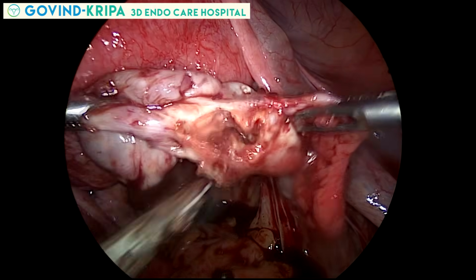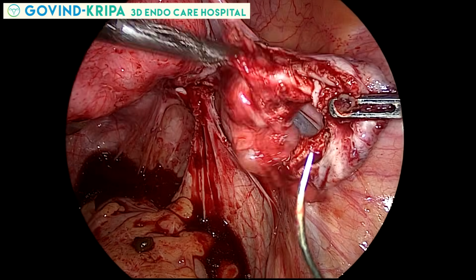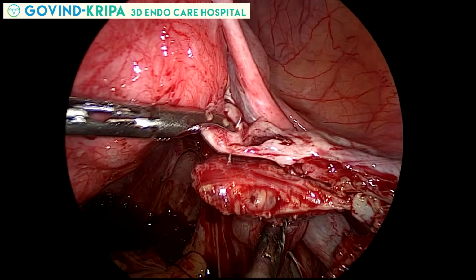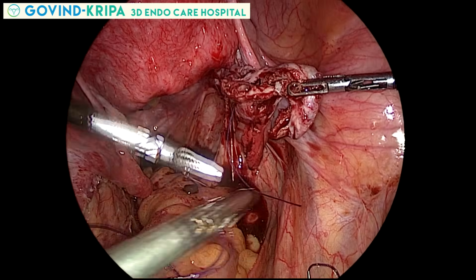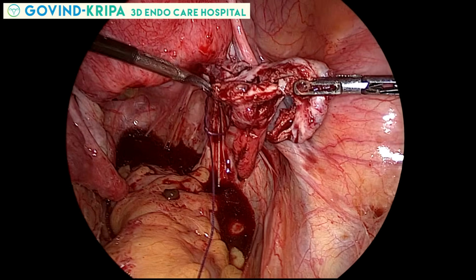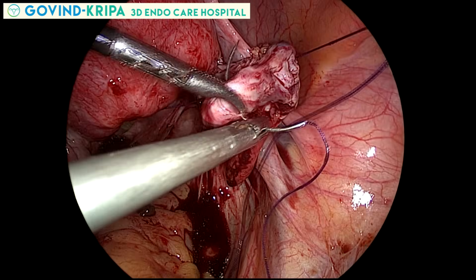One more very small endometriotic cyst is seen, and that is also excised. Ovarian reconstruction is done with the absorbable suture material, and the same suture is used for the temporary ovarian hitching to the anterior abdominal wall. This saves a lot of time and gives a good surgical exposure.